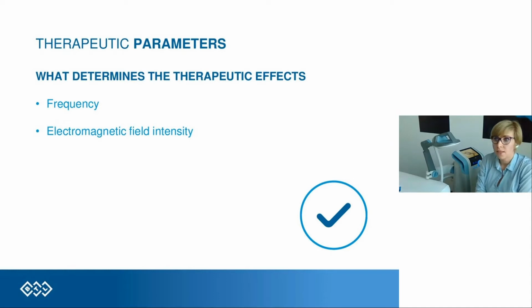So the tissue never knows what kind of frequency and what kind of intensity modality it will receive, because it's not a cycle. So every section is different.